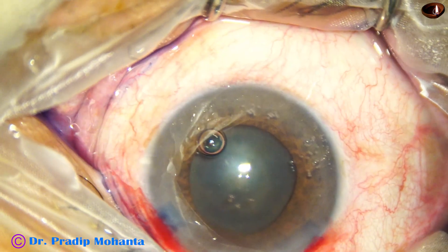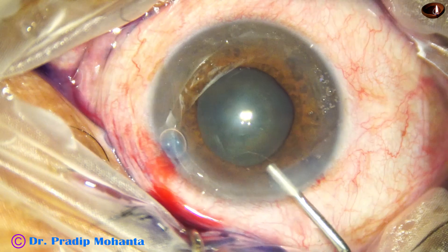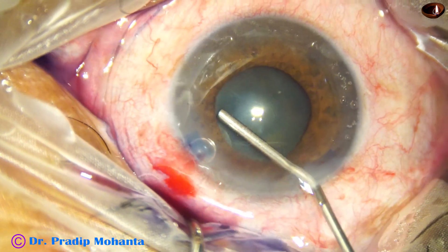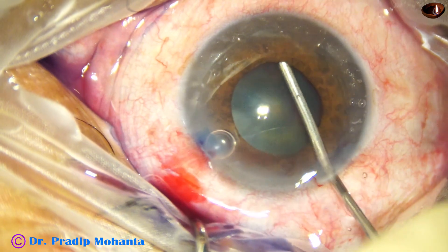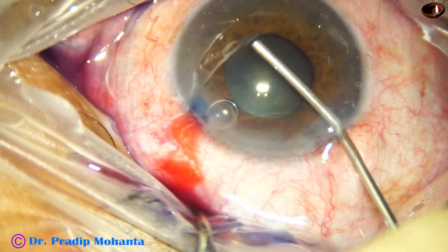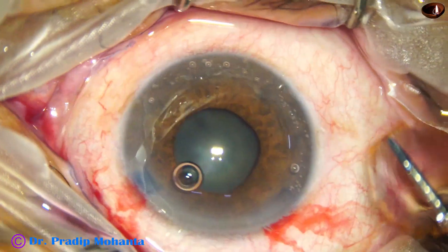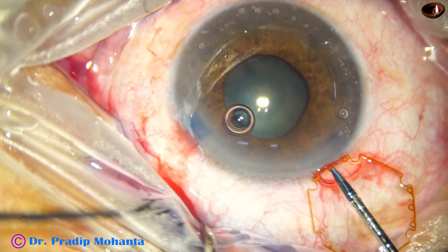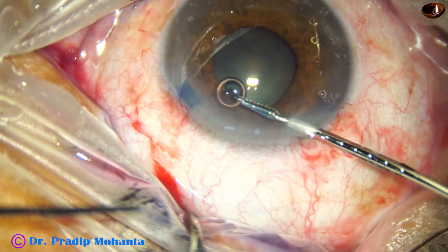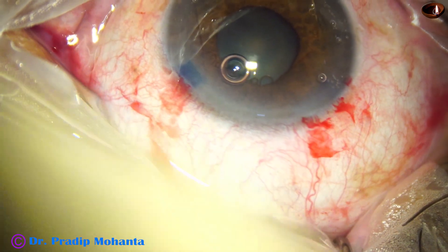The anterior chamber has been underfilled and some visco has been placed under the iris. I am touching the iris to constrict the pupil a bit so that I can easily engage the flanges of the B-Hex. Now this air bubble is disturbing and visibility is poor.